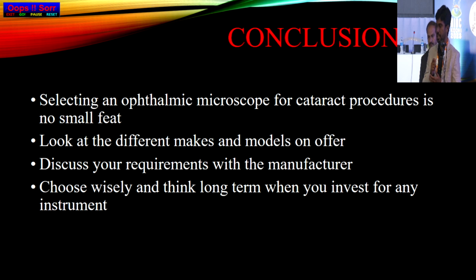The cleaning again causes damage to your optics. The way we clean, it causes the coating to peel off, and using alcohol is another issue which I found. We should not use alcohol based swabs for cleaning. It is advisable to just use the blow and clean technique, where we don't peel off the coating. That was a hard lesson that I learned with the previous microscope, because of using alcohol based cleaning very aggressively, the coating peeled off.